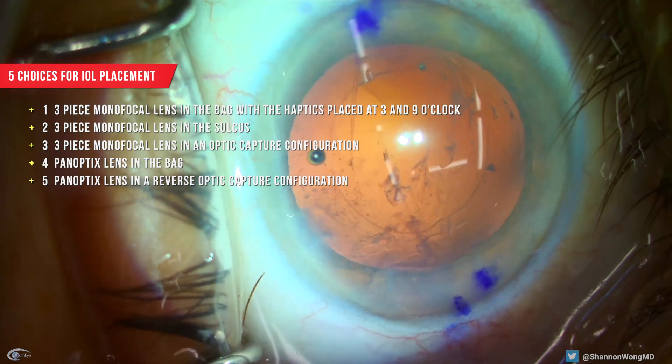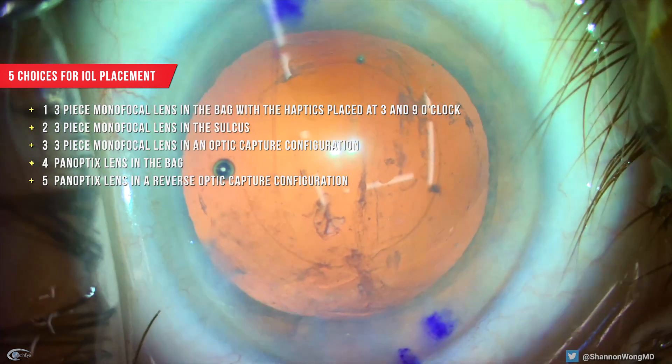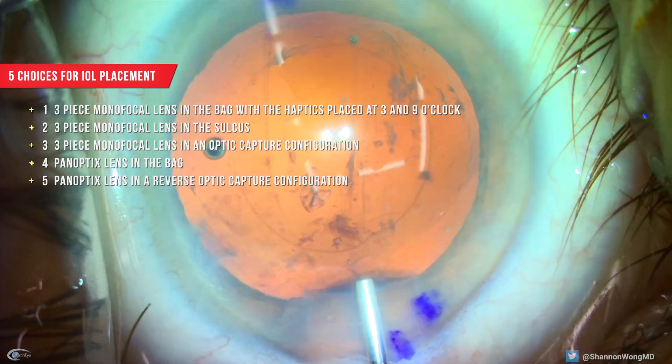Number three, a three-piece monofocal lens could be placed in an optic capture configuration where the optic is in the bag and the haptics in the sulcus.